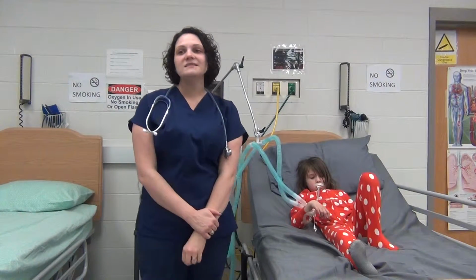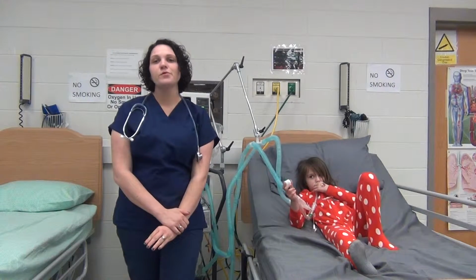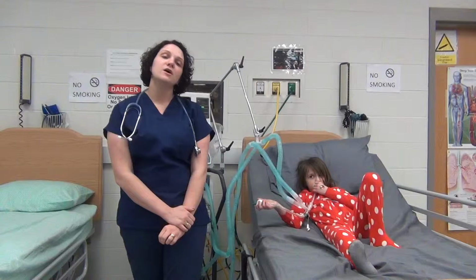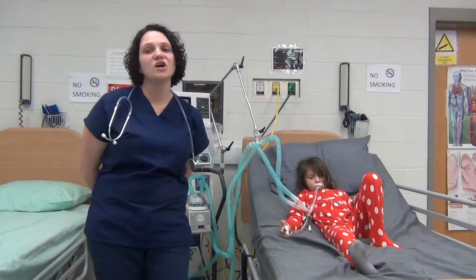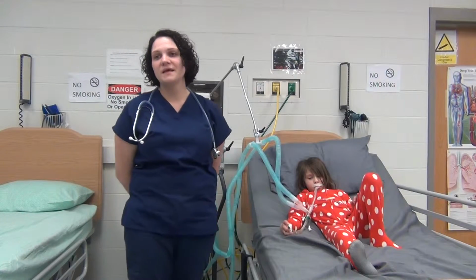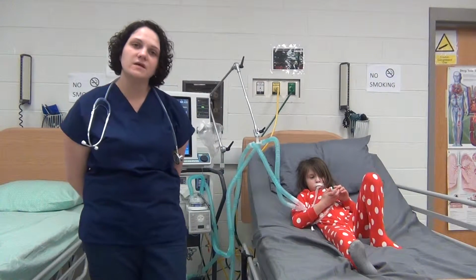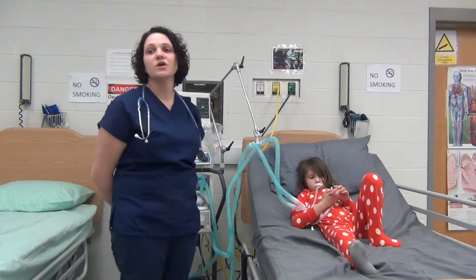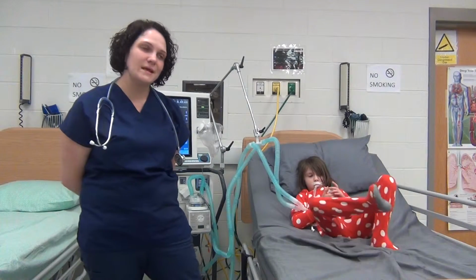Her vital signs are stable and normal for her age and her cardiopulmonary disease history. Her SpO2 is 91%. The attending physician, Dr. Nose, wants me to wean Mrs. Tubbs to the minimal mechanical values of SIMV to a rate of 4 due to her long-standing COPD.